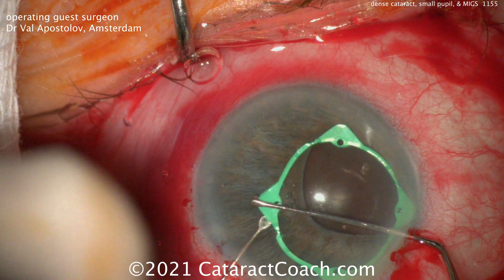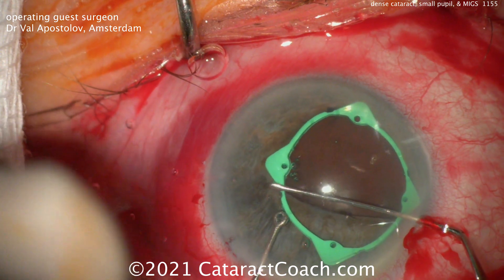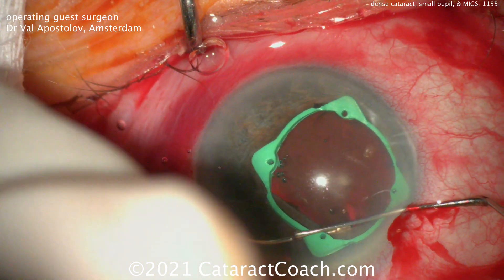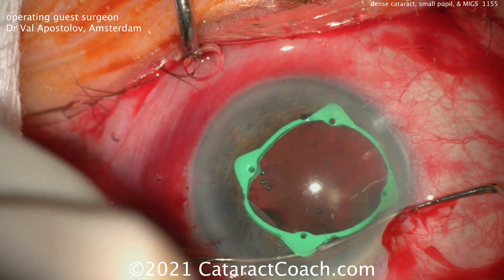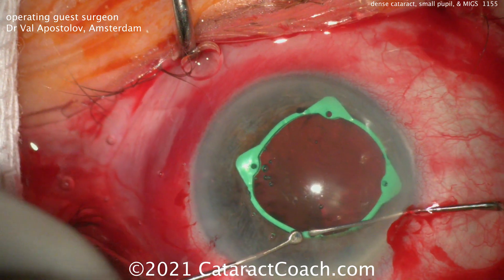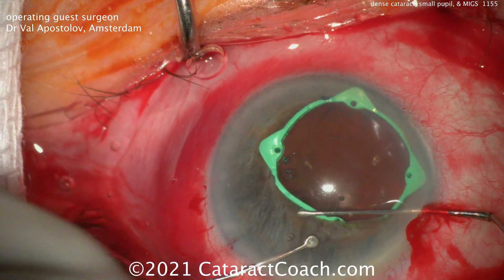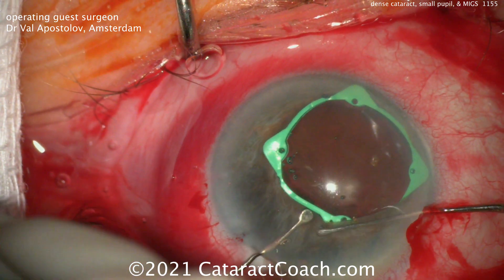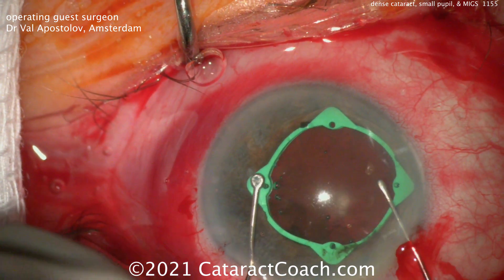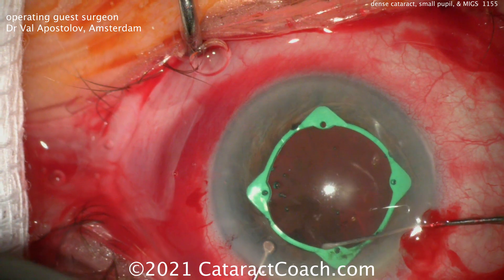There's two corners hooked. Let's see this two-handed technique to expand the pupil with the other hand — very slick. Once you get these four corners of the ring hooked over the pupil margin, you can center up the pupil and the ring to where you want it. We're going to show you this video because there's so much to be learned here. This is a dense cataract — not only a small pupil but a dense cataract. Elderly patient, weaker tissues, and we're going to do a MIGS procedure at the end.